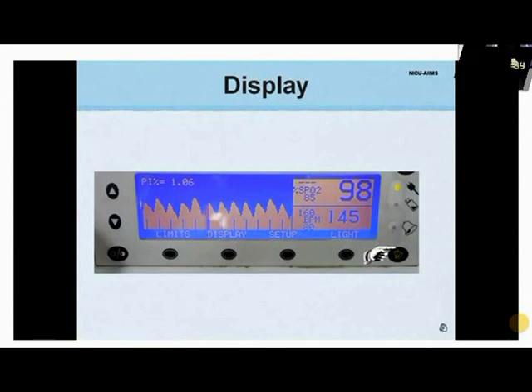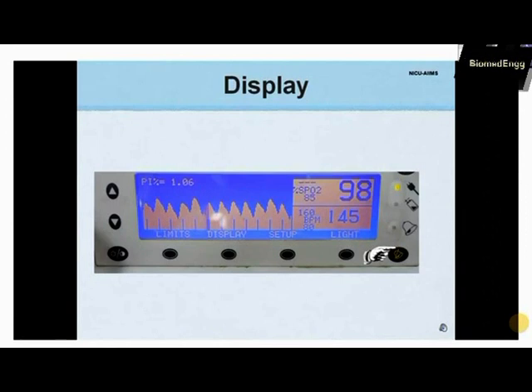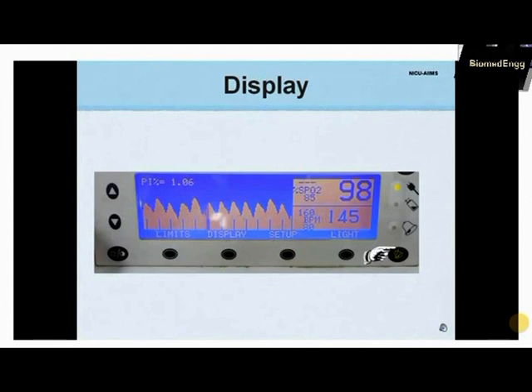The alarm silence button can be used to mute the alarm noise. By pressing this button three times within 3 seconds, the alarm can be muted. When an alarm condition occurs, the alarm button light flashes and the alarm message appears, but no audible alarm will sound.